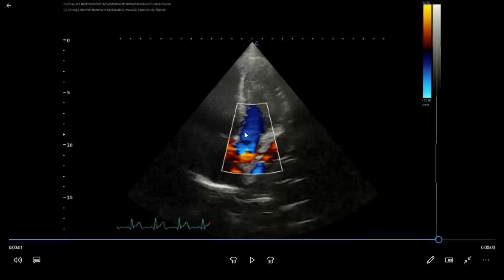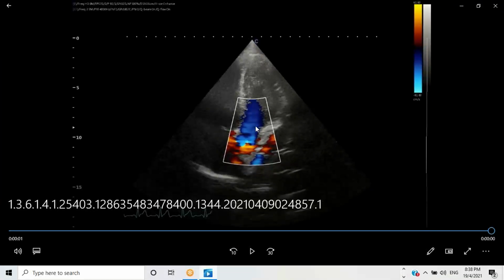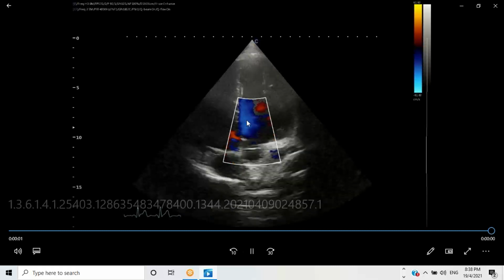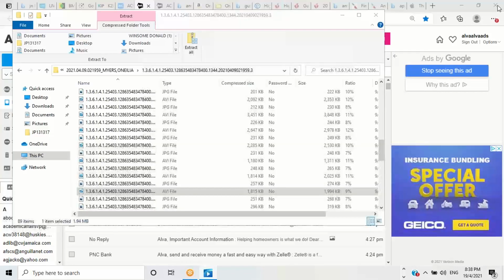You do the same thing across the aortic valve. So this is the 5-chamber view. From the 4-chamber view position, you just pull the angle of the transducer downwards a little bit to open the aortic valve, and you put your color. You're looking for aortic insufficiency or any abnormal flow.